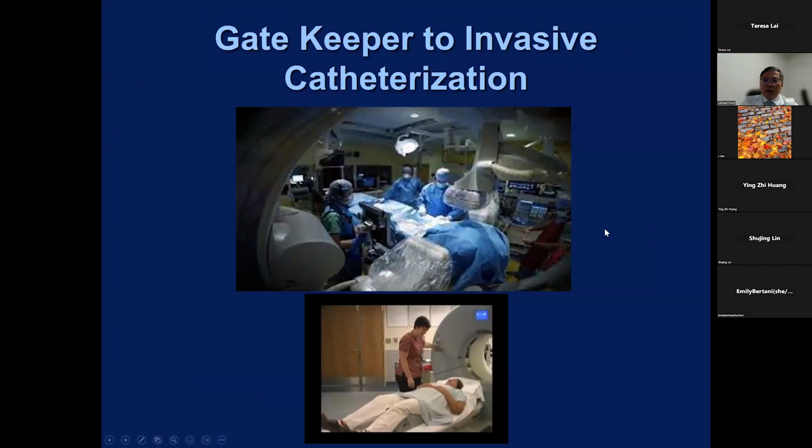So this is the CCTA on the bottom, a patient lying comfortably on a couch, ready to be transferred into the gantry. And on the top is the sort of scary operating room where cardiologists perform angiography, catheterization. You can see the big difference, and they pretty much offer something very similar. Both of them give you an anatomical look of the human coronary.